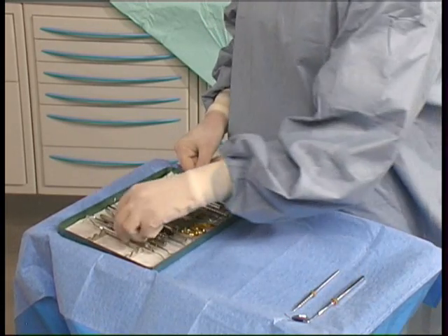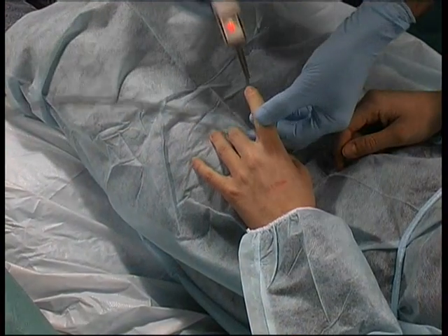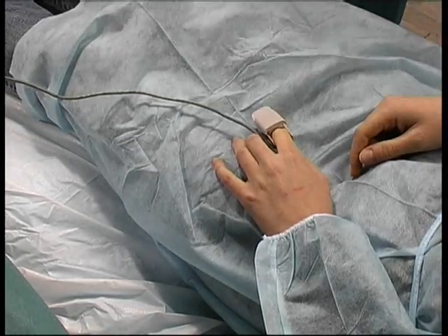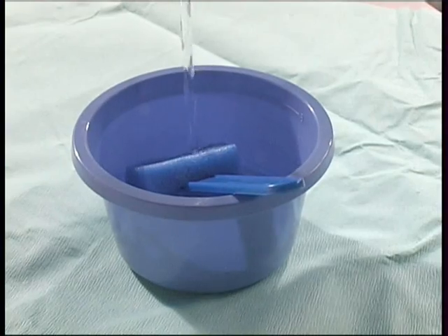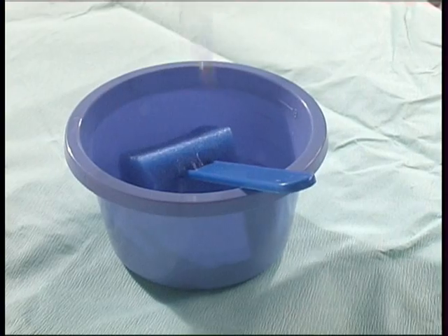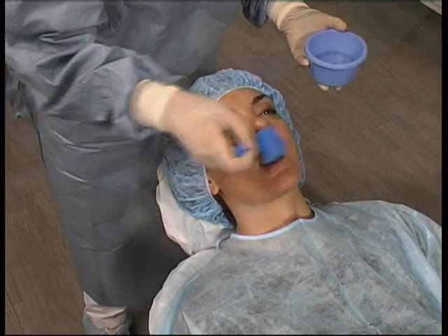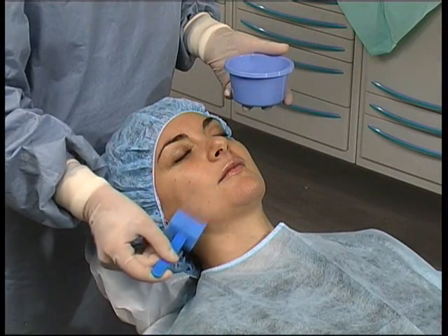We can now proceed with the preparation of the patient. The aim must be to isolate the operating field from potential external contamination. The patient is hooked up to a pulse oximeter that monitors the parameters during the operation. Using the special kit, the assistant disinfects the skin around the oral cavity, starting from the lips and moving outwards.